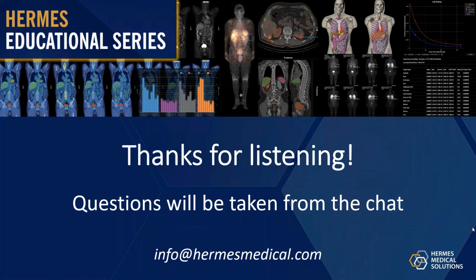Yeah, I think it depends on the application. At the moment, we are preparing a paper where we have used the anatomical reconstruction in bone SPECT CT, and there it seems to work quite well. But of course the anatomical and the emission images should have at least some kind of correspondence.